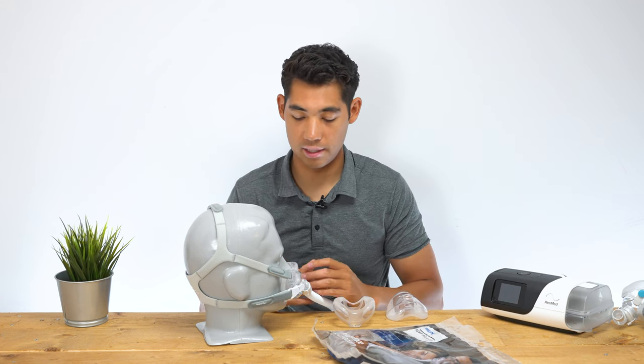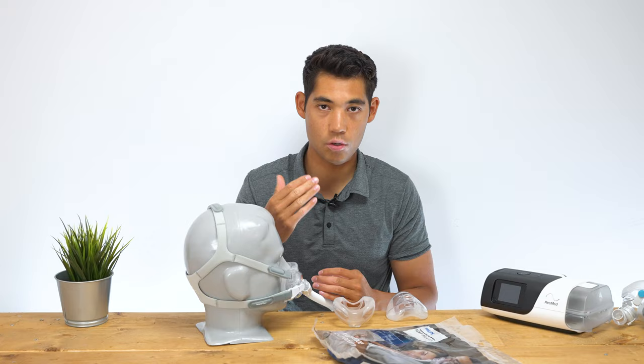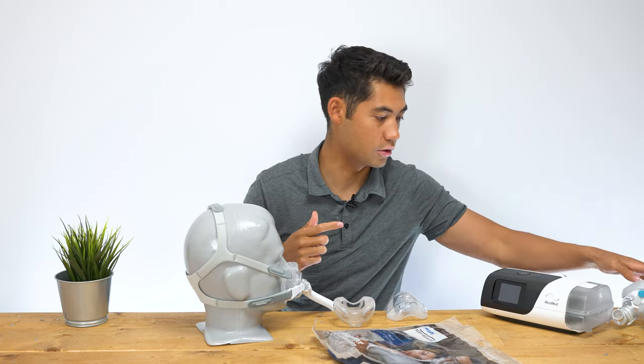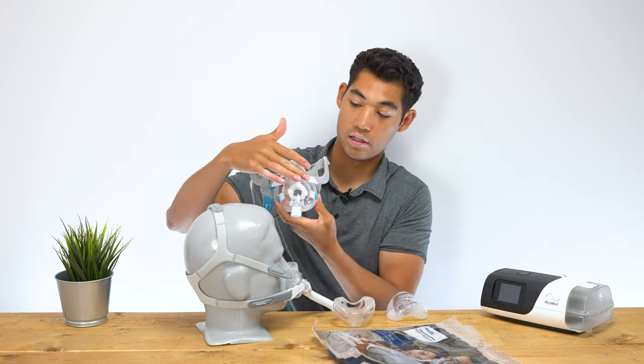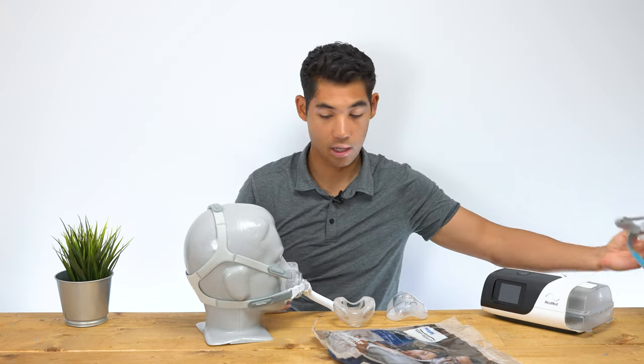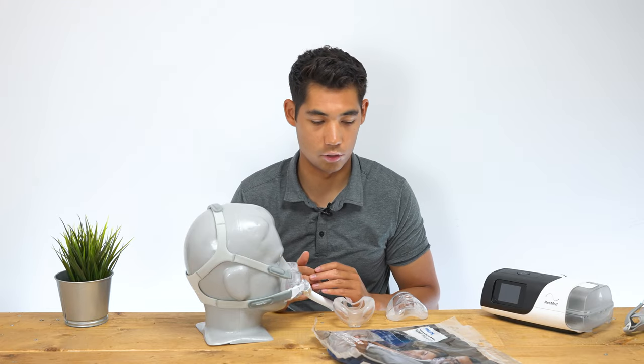The Amara View mask is a hybrid full face mask, which means it's covering the mouth as well as the nose, but it's not going over the top of the nose as you might be familiar with. For example, here we have a ResMed F20 going over the bridge of the nose. As you can see, the Amara View is a cradle going underneath, and we'll explore that a little bit in a minute.